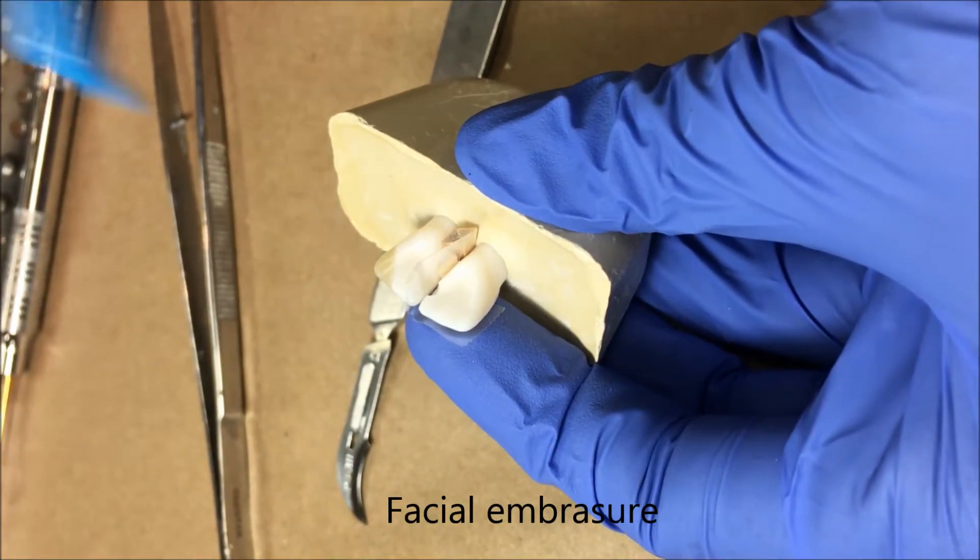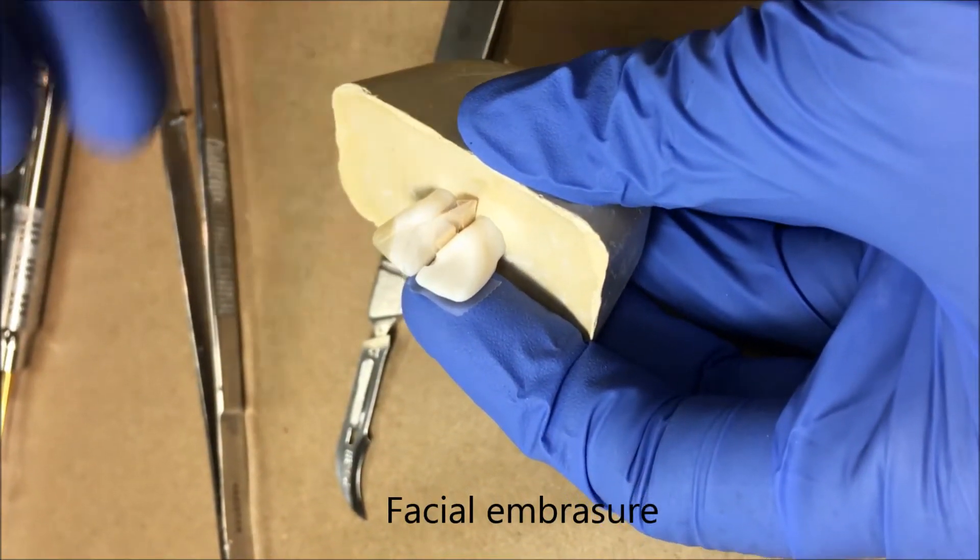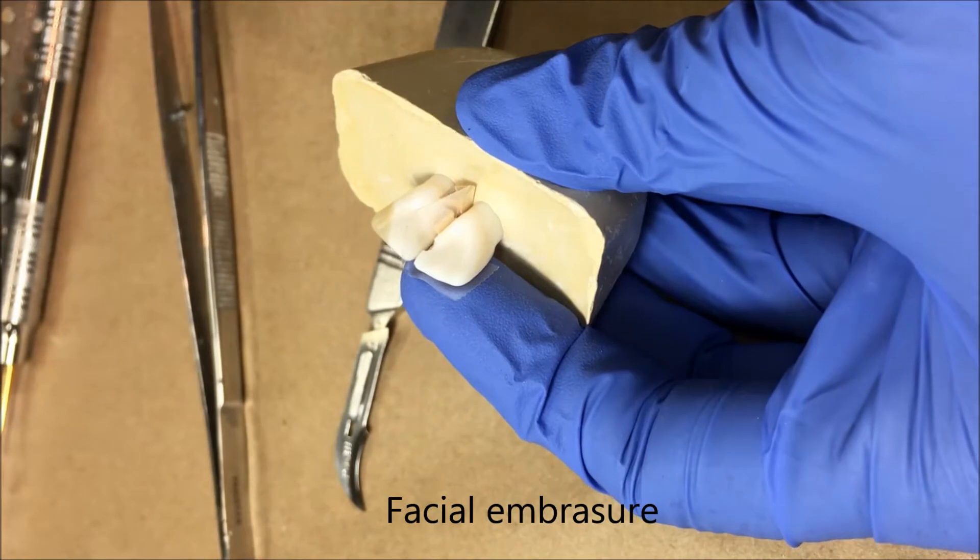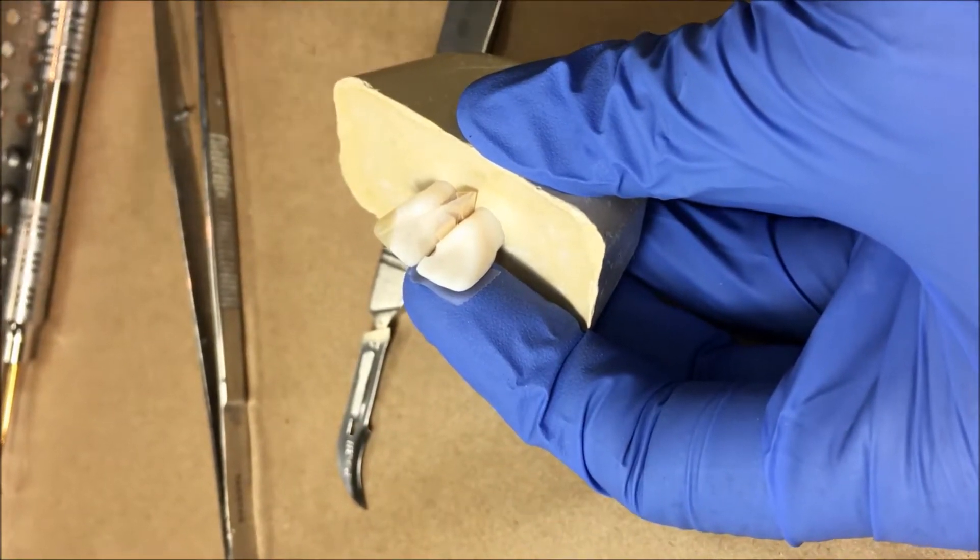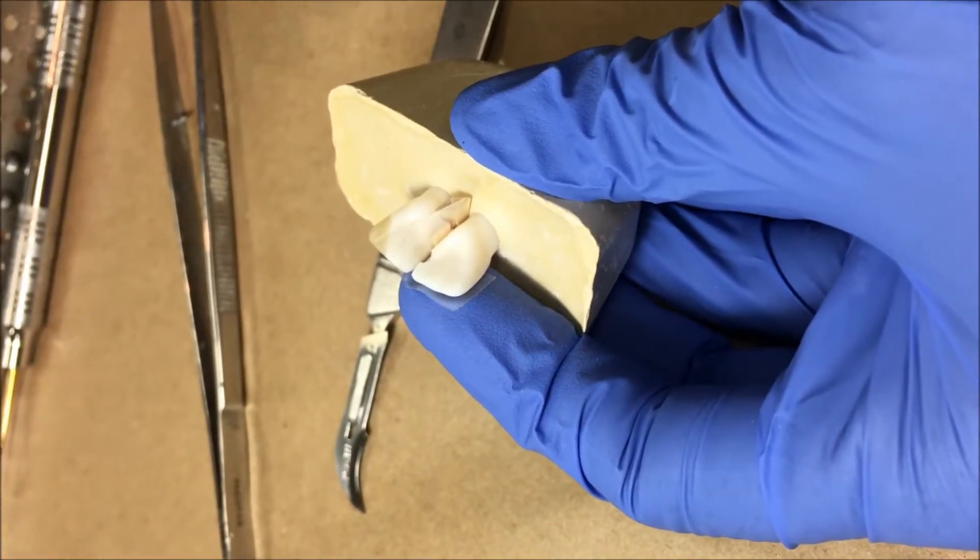It makes a real nice embrasure as well. That matrix is already creating my facial embrasure. If I'm lucky I maybe have a couple of little bits of flash to clean off there and I shouldn't have to do much more.